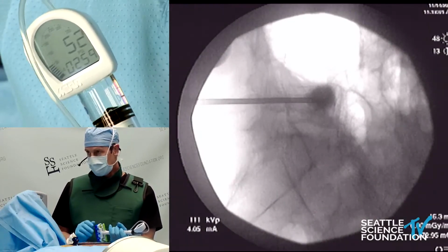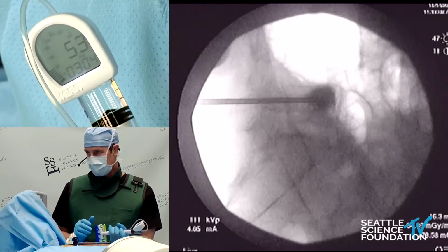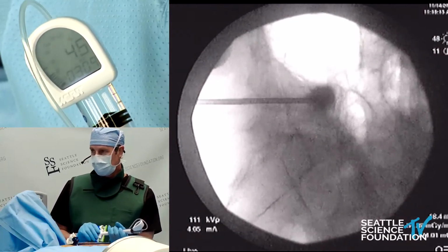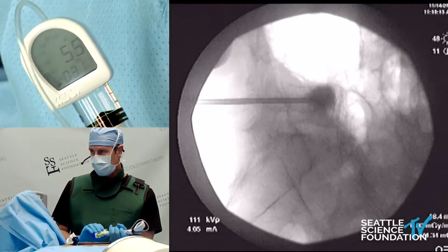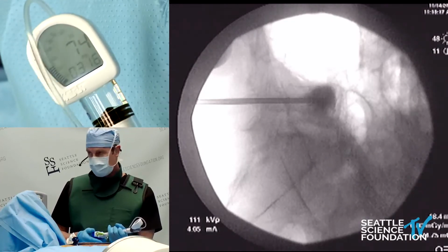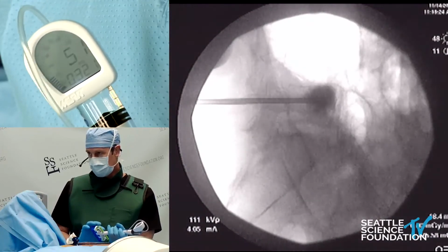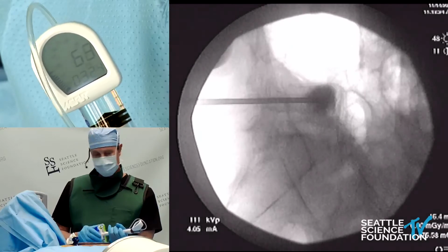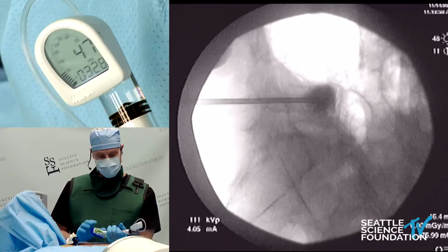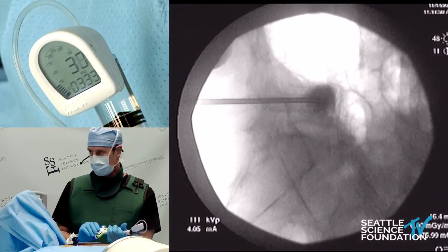And so you get the idea, once it goes into the interstices of the bone, it kind of locks it down between the pedicles. The orientation of the balloon is key for reducing most common fractures that involve the middle and anterior portion of the vertebral body. And the balloon is well engineered. It's high pressure, and it is also a balloon that doesn't tend to deform. So it tends to stay exactly where you put it.